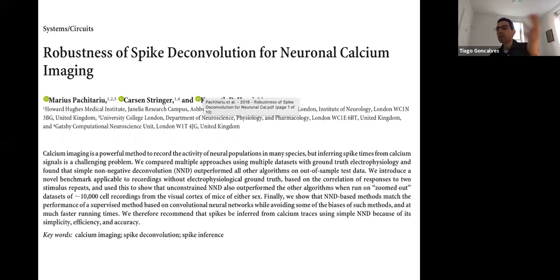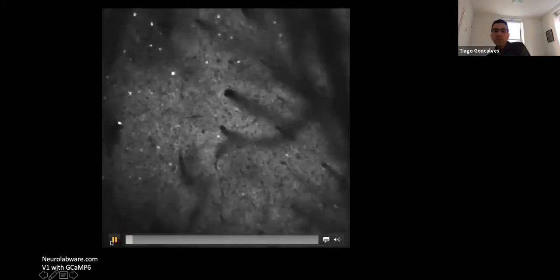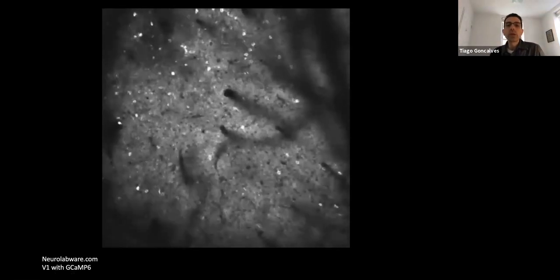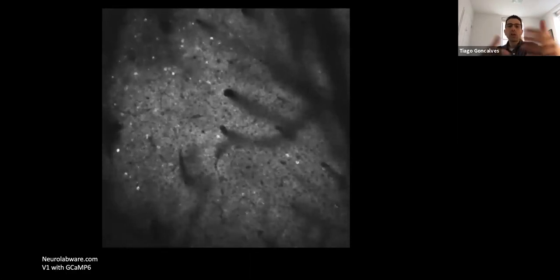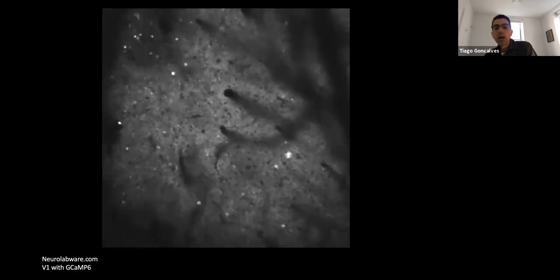And of course, we like to believe that, and we do. I can't do that in the hippocampus. I can't patch there, but I can do that in the cortex. So, of course, the type of imaging most people do with activity is imaging activity of cells. Here you see in the visual cortex, a lot of cells flashing. This is the most common form of activity imaging.